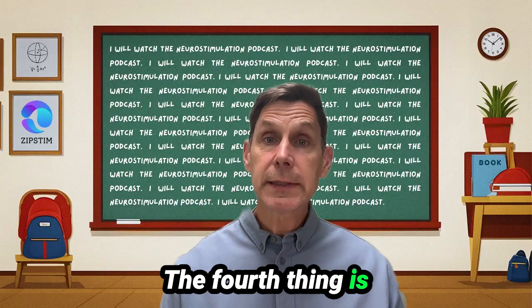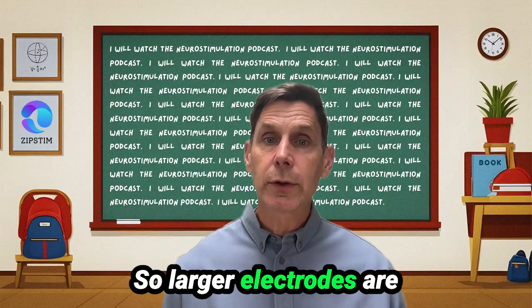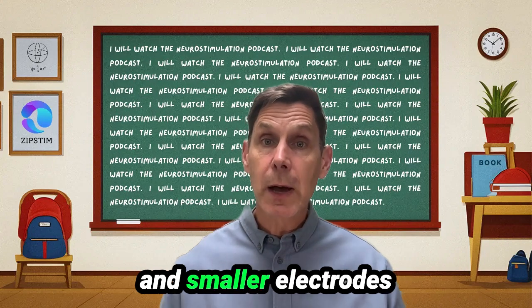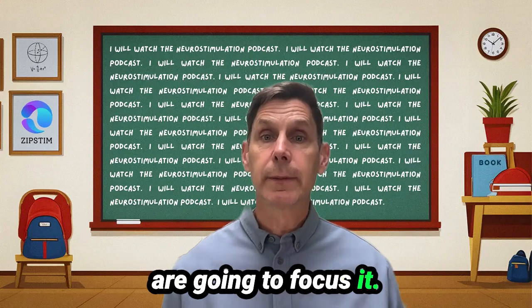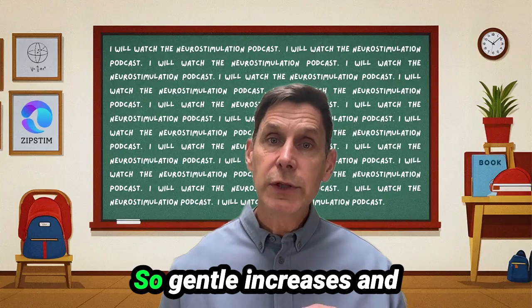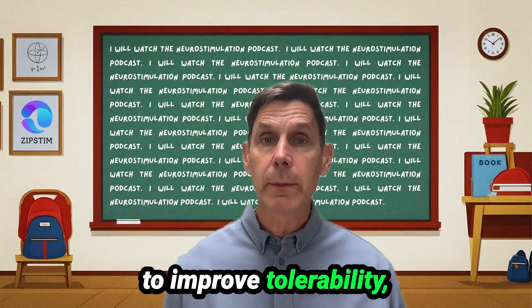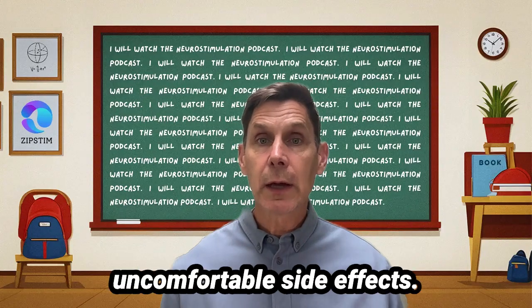The fourth thing is electrode size and material. So larger electrodes are going to spread the current and smaller electrodes are going to focus it. The fifth parameter is ramp time. So gentle increases and gentle decreases seems to improve tolerability, basically reducing uncomfortable side effects.